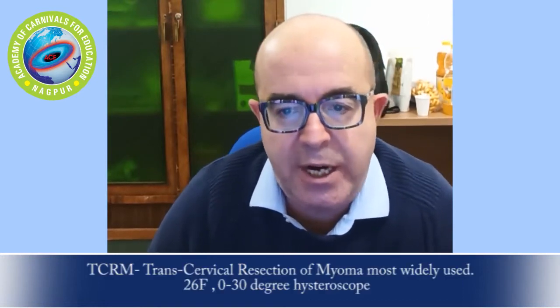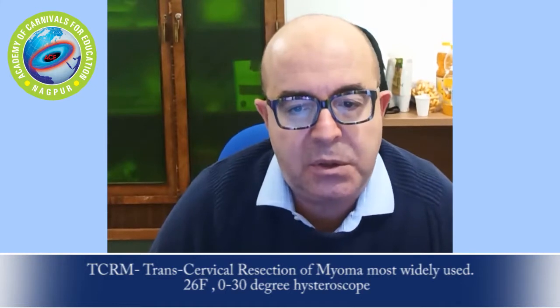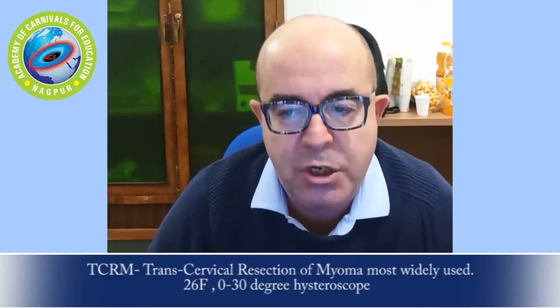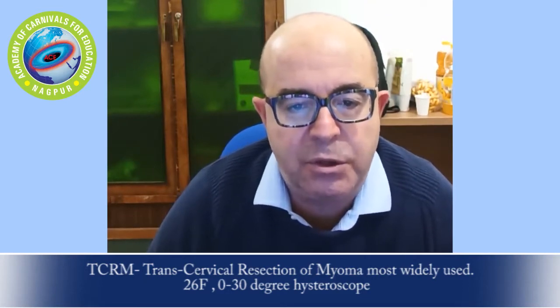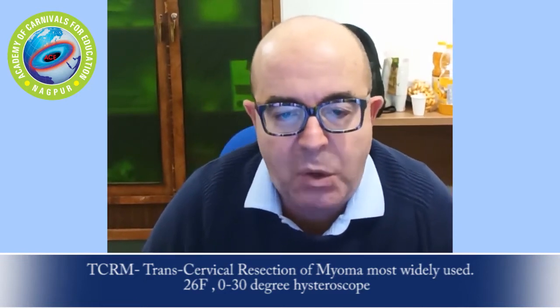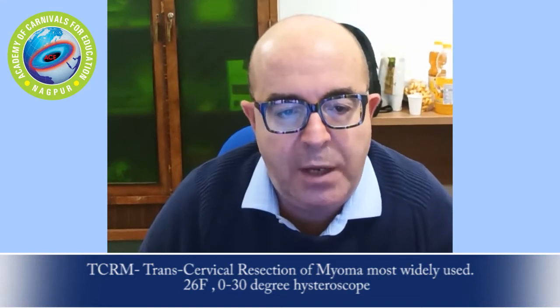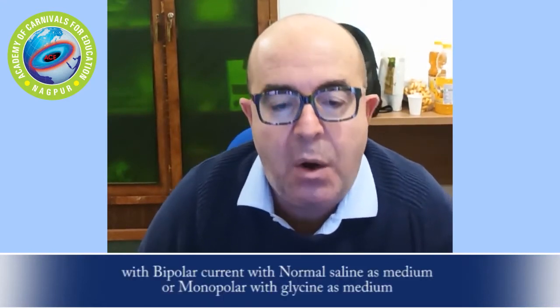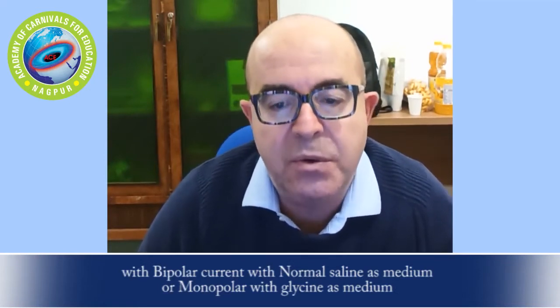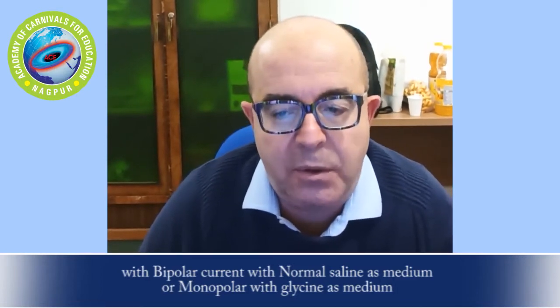The transcervical resectoscopic myomectomy, TCRM, by hysteroscopic resectoscope is the most widely used tool. The resectoscope consists of a 26 French gauge outer sheath diameter and a 0 to 30 degree oblique telescope with a 4 mm outer diameter. TCRM can be monopolar with an electrolyte-poor distending medium such as glycine 1.5% or sorbitol 3%, or bipolar, most commonly used, with the use of isotonic saline solution. Bipolar hysteroscopic myomectomy may be a well-tolerated alternative compared with a monopolar hysteroscopic myomectomy.